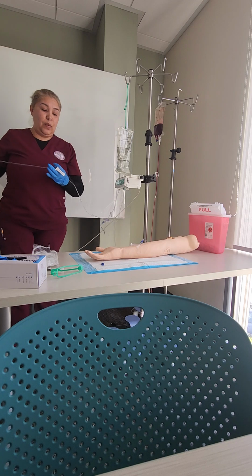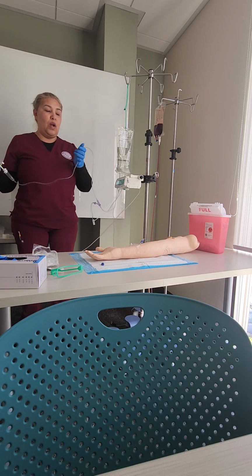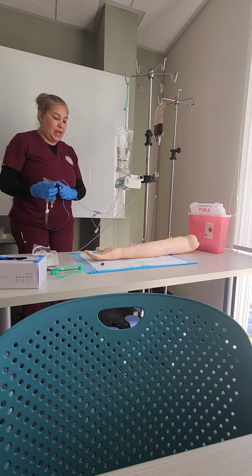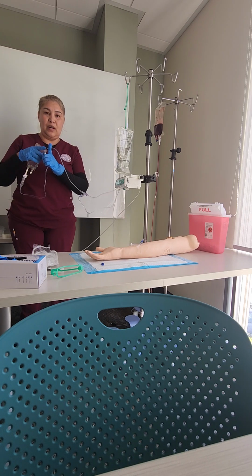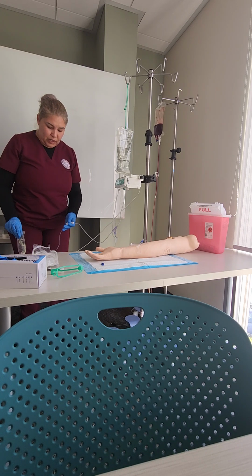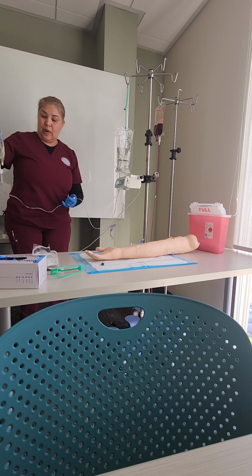Now what I want to do is prime my secondary, and to be able to do that, I want to open up the clamp, and I want to bring my bag lower so that I can get some fluids to go back up and remove all the bubbles that are in my line. Okay, so I will do that now. And as you can see, all the bubbles from my line are going back in. There's no more bubbles, so I will stop.